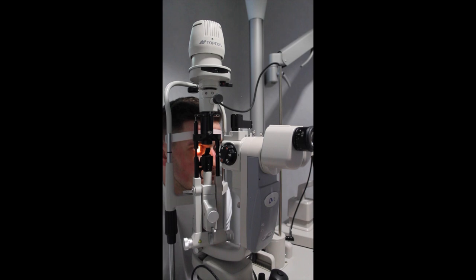Sclerotic Scatter is a technique that can be used to find abnormalities of the cornea such as foreign bodies.